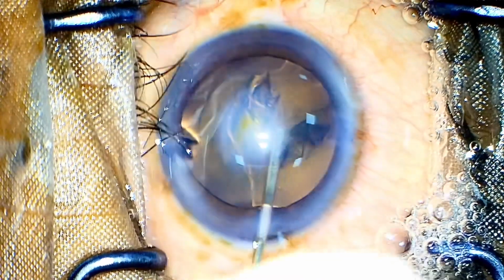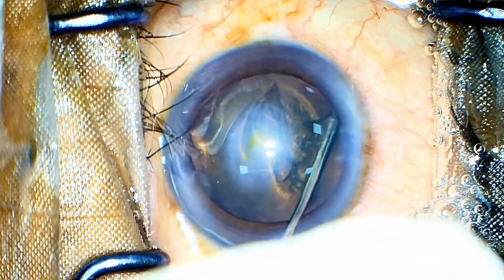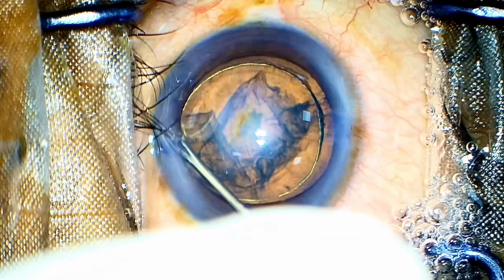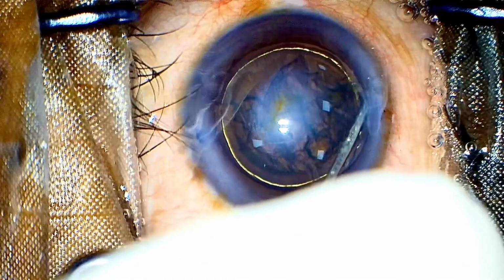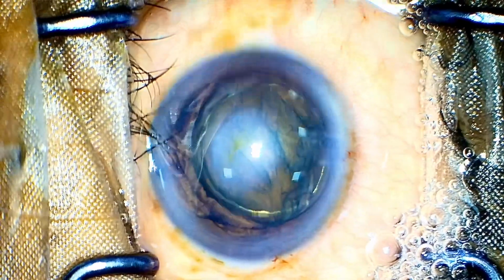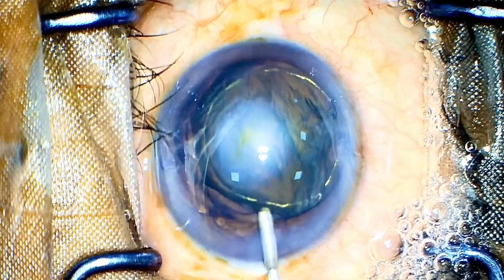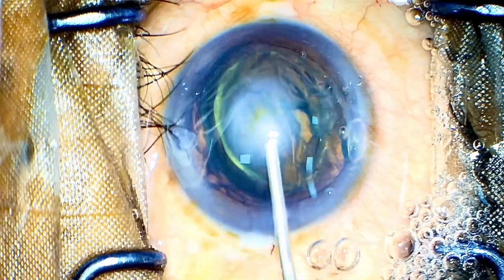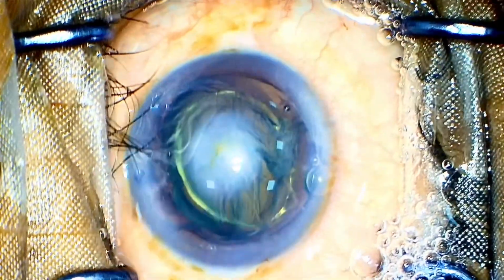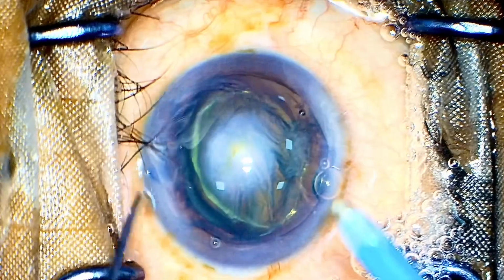Tip number 2, very important: I'll make these multiple hydrodelineation and hydrodissection waves which will ease and just pop that endonucleus out for me, because as my visibility is poor, I won't be able to get hold of the details of the capsular bag. So I am making these multiple waves so that they aid me in the phaco process. As you can see, this baby-like endonucleus, one pole is out of the bag and I'll just grab it with the vacuum of the phaco. I don't even need to put a lot of US energy in the anterior chamber.